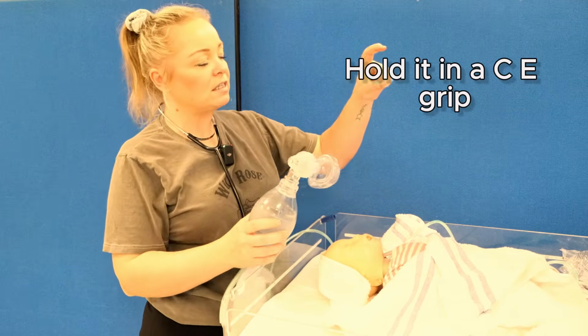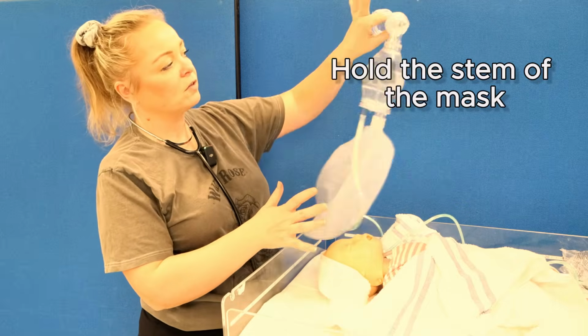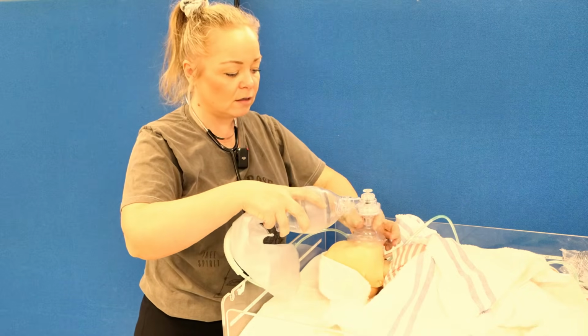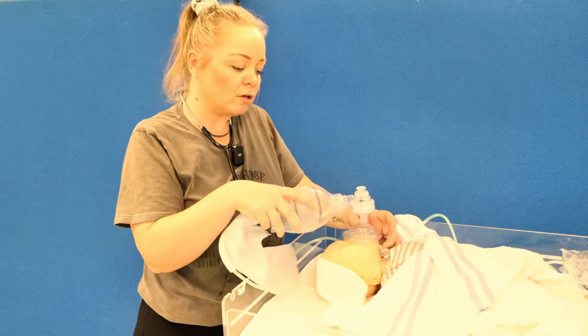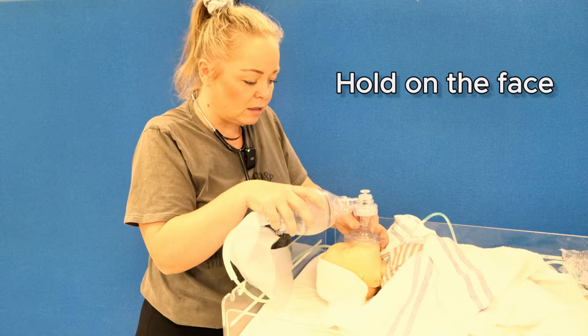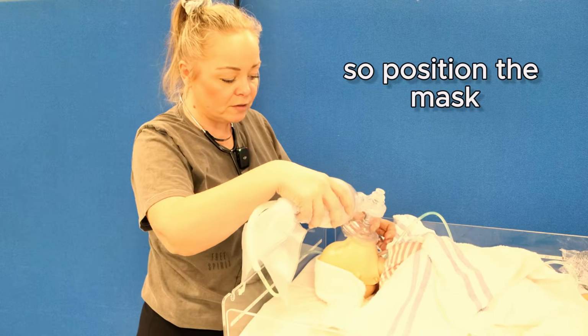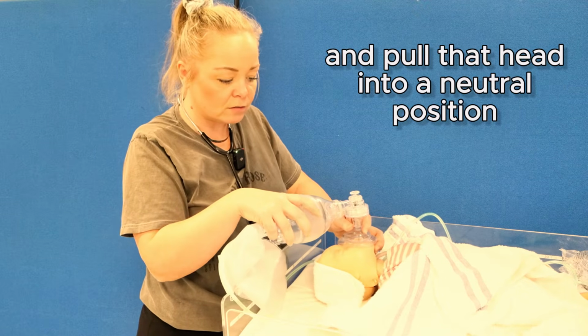So you're going to hold it in a C-E grip. There's my C, and that's going to be my E. So we're going to hold the stem of the mask like that, place it onto the face, and hold the chin. Don't push up on the tongue because you're going to cause an obstruction. So we're just going to hold it on the face and just support the chin into that nice neutral position. So I'll position the mask, put some pressure onto the face, and pull that head into a neutral position.